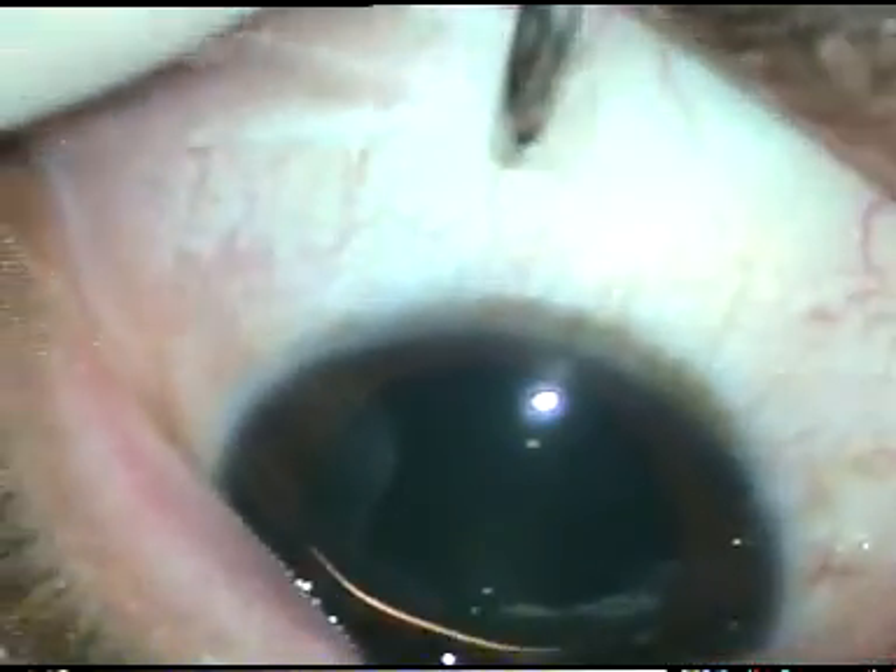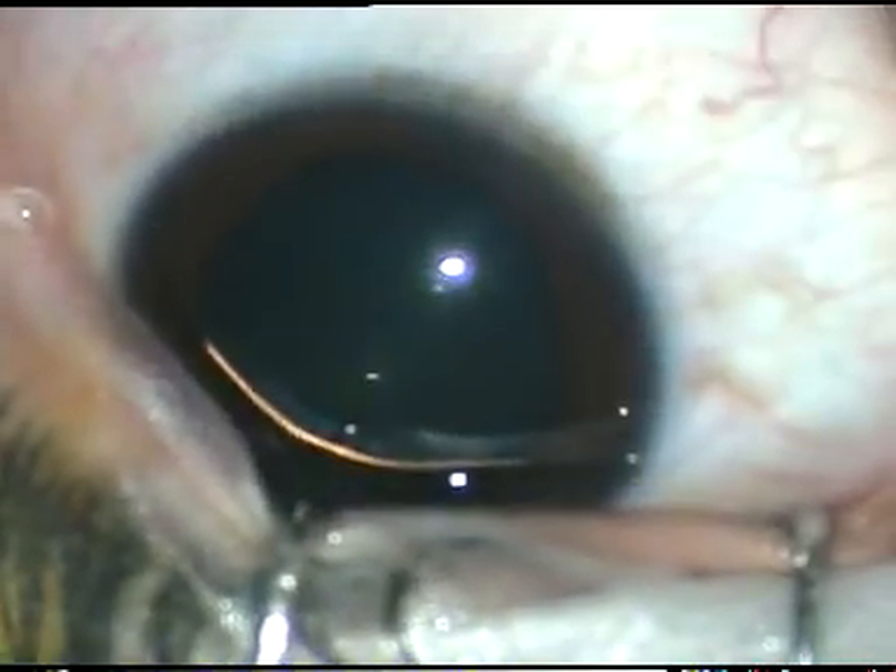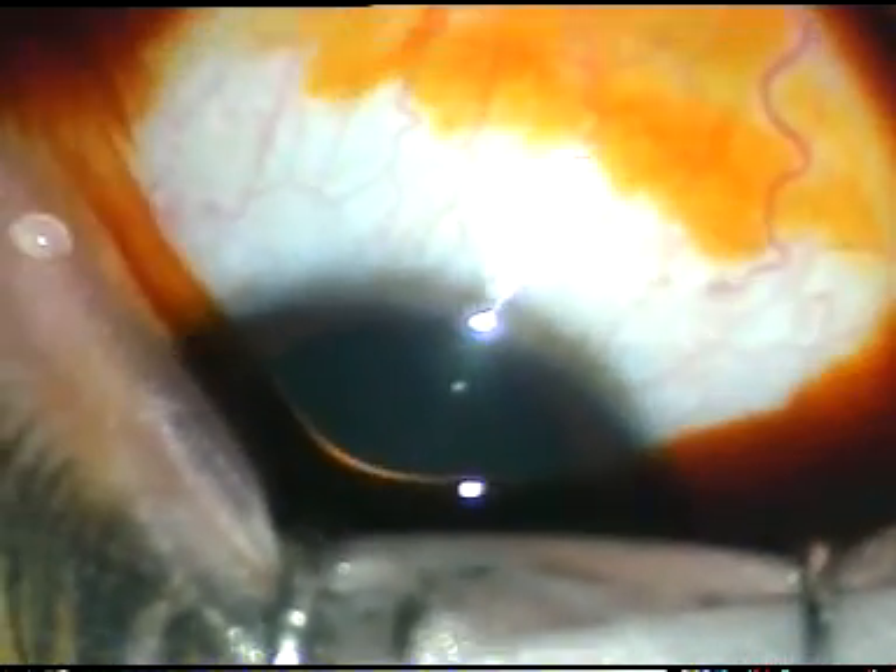Now a wire speculum is placed to keep the eye open. A thorough wash of the ocular surface is given using betadine 5% lotion. Betadine is povidone iodine — that is polyvinylpyrrolidone iodine. Povidone iodine has been applied in the preparation room, and this is the second time it is being applied on the operation table.